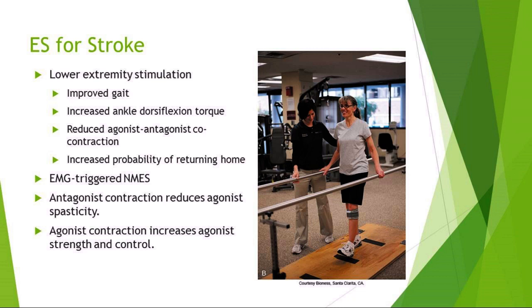And I've actually worked with several patients who were fitted for these functional electrical stim dorsiflexion devices, and it drastically improved their gait. Of course, they had to do 6 months to a year of PT before they were at the right stage to use these devices, but it's really nice to see this in action.